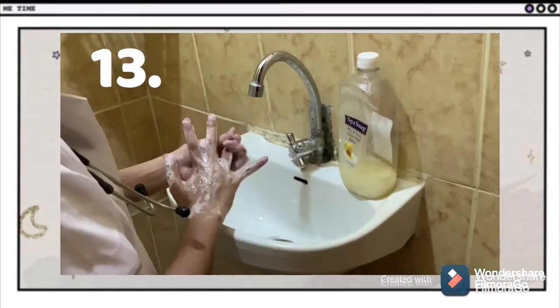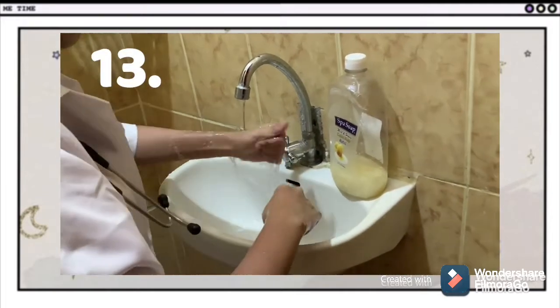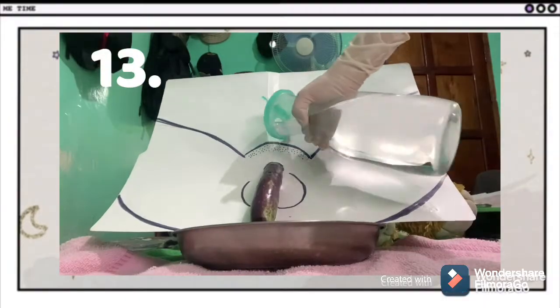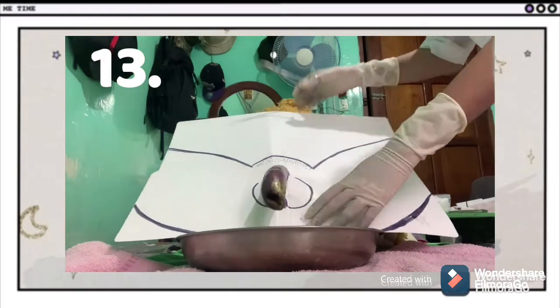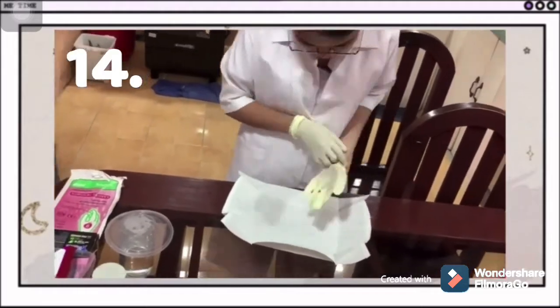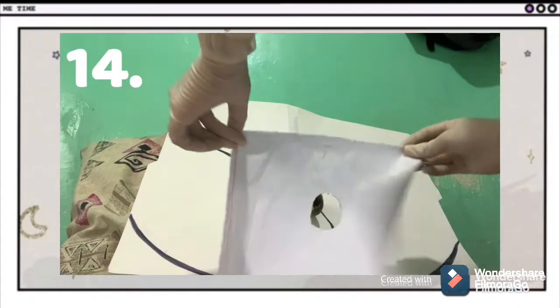Wash hands to prevent the spread of microorganisms. Put on gloves. Then do perineal care or flushing. Cleansing the perineal area prevents introduction of bacteria. Discard gloves and put on sterile gloves to avoid cross-contamination. Grasp the upper corner of the fenestrated drape and unfold it.